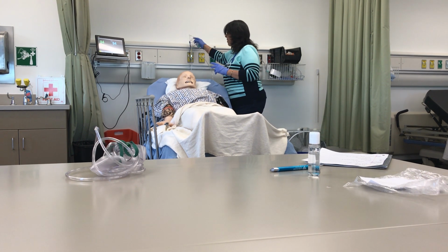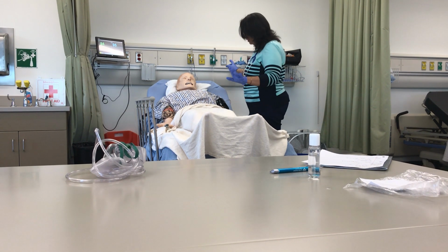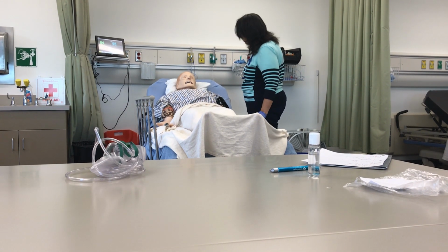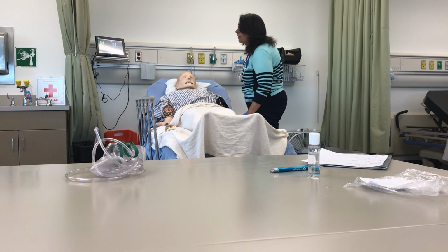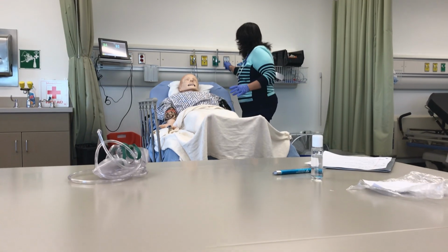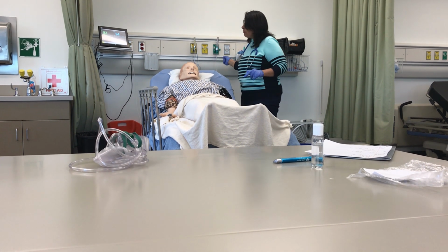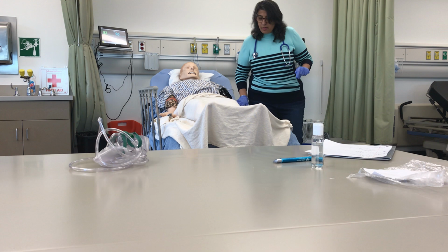I'll have to tell you what happened with one of my patients now. Let me finish the assessment. All right, here you go. How are you feeling? Took the oxygen away. Much better, yeah. I'm gonna wean you down to room air and see how things are going right now. Just gonna keep the monitor on for a few minutes.